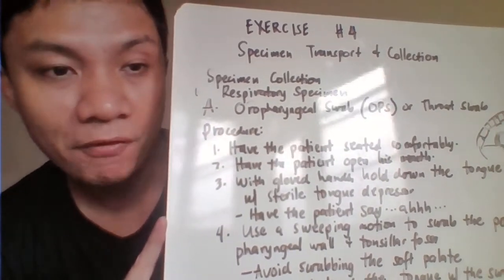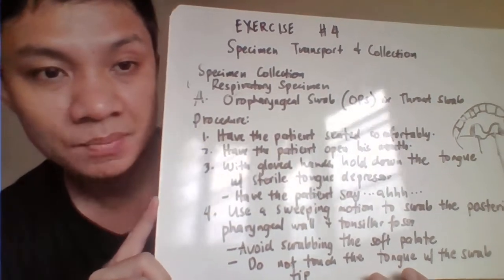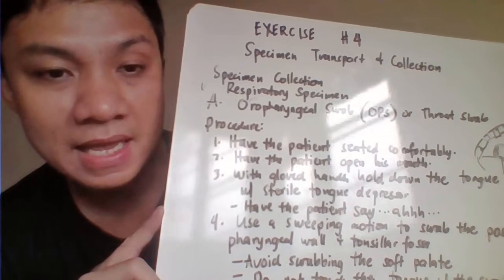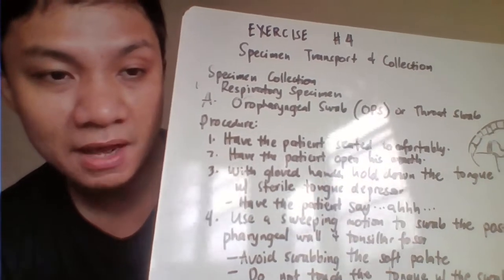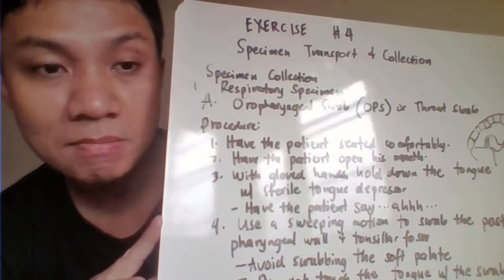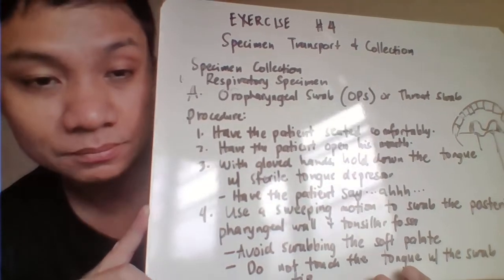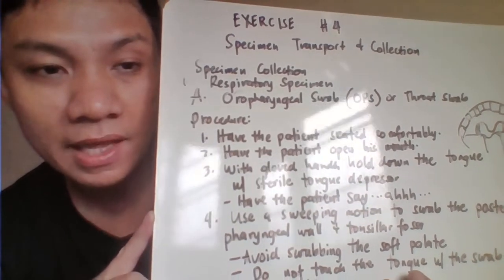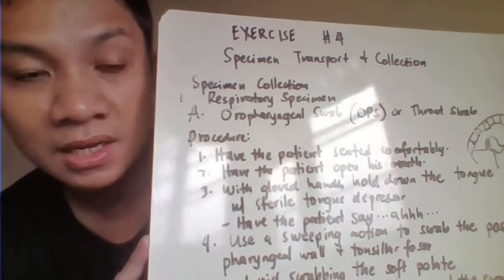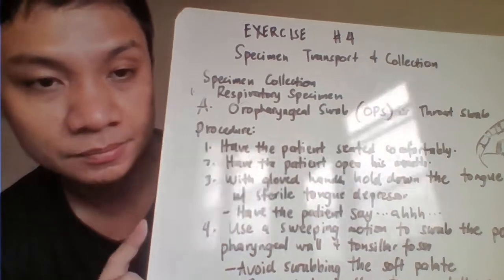So you need to really perform each of your specimen collection processes correctly, because if you are not able to perform correctly and what you have recovered is the normal microbial flora, it would cause a problem with the treatment of the patients. Because again, what we are diagnosing here is supposed to be the true pathogen that tries to cause infection and not the normal microbial flora.